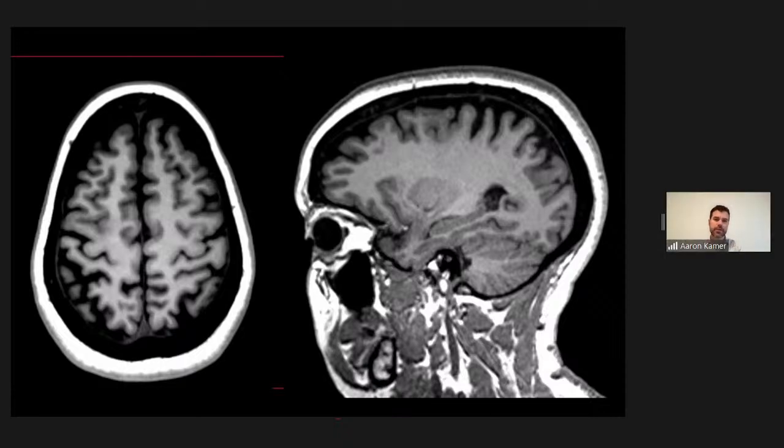And this is just a chronic seizures patient. Oh, okay. Don't worry, I'm not switching gears completely. So yeah, what I love is that you're taking some time on this, because these abnormalities are very difficult to identify. What if I told you the EEG is localizing to the right frontal lobe? Right frontal lobe.